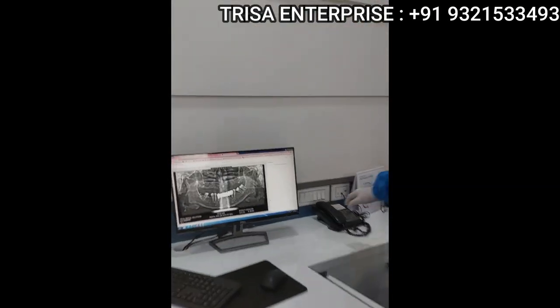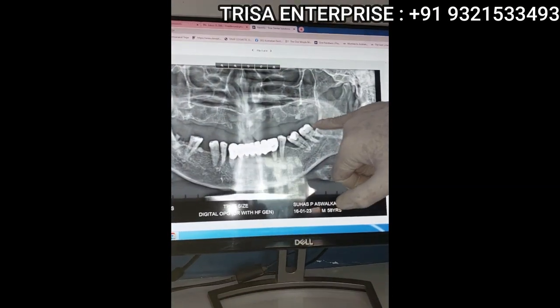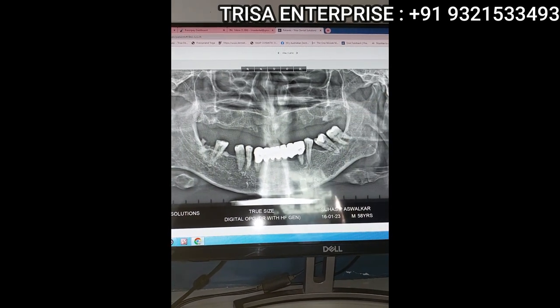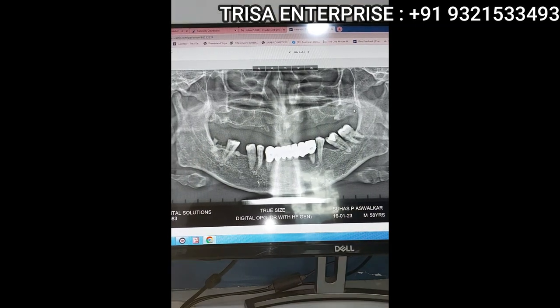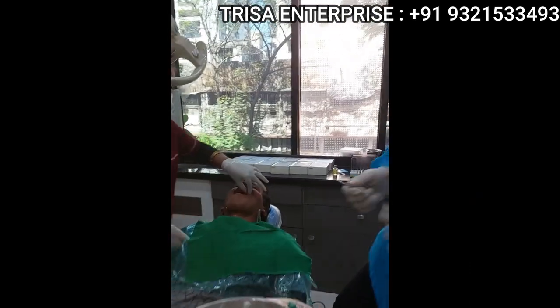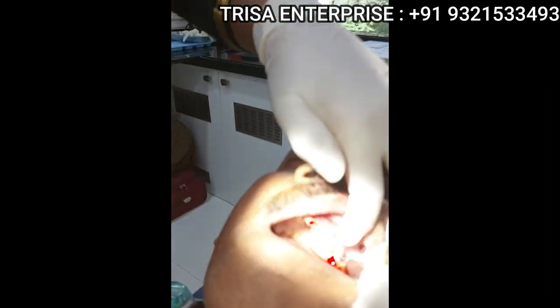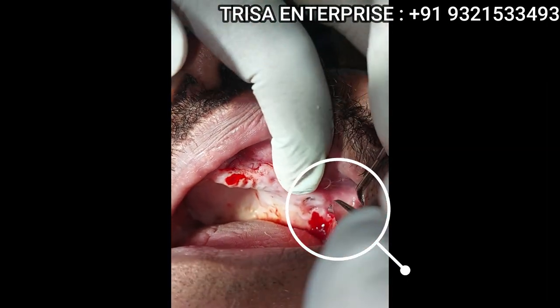Let me quickly show you the case. I'm operating on the left side right now, and I've already placed one implant in this area. Let me show you in the mouth — you can see this one implant is already placed here.